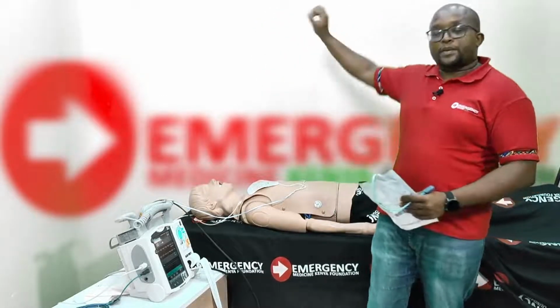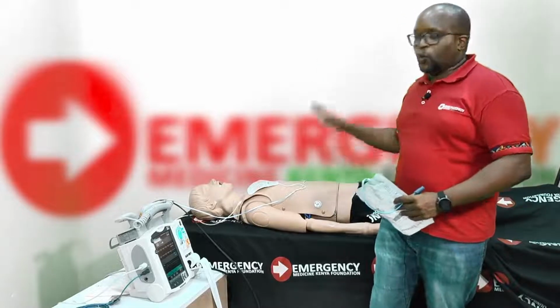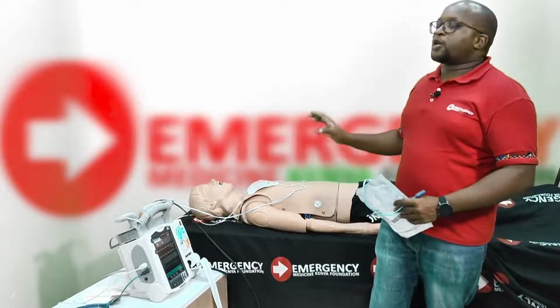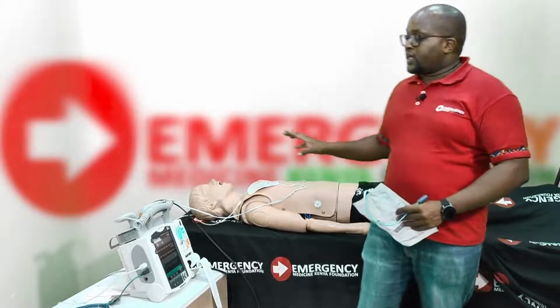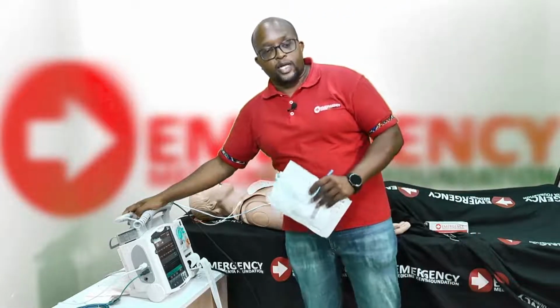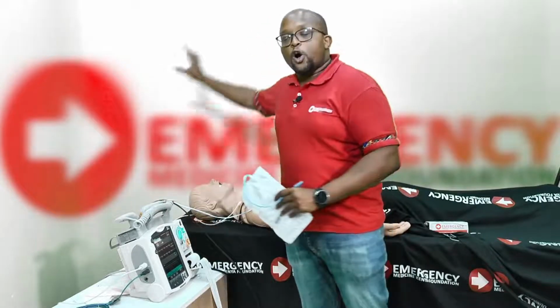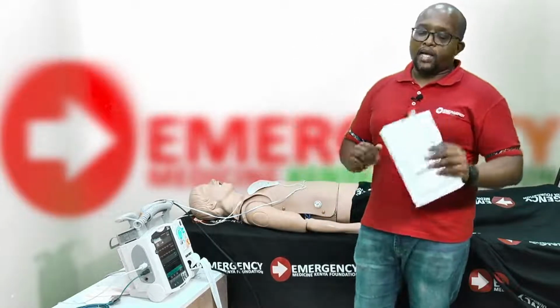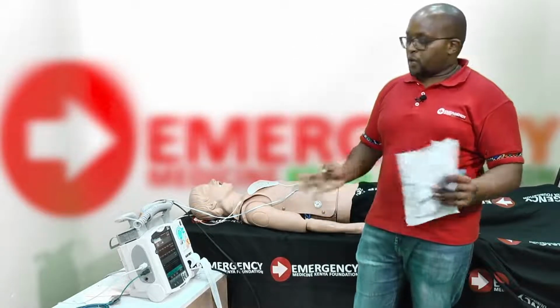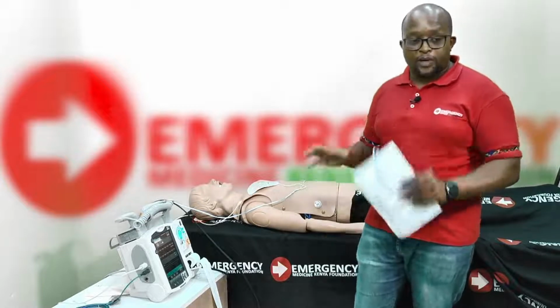And then capture the patient on your machine. When you capture the patient on your machine and go through electrical capture, mechanical capture, physiological capture, then this machine is going to go on standby, because the heart rate on your machine is higher than this one, and this one is on demand mode, in which case then you can disconnect the patient, and the EMS guys can go with their machine. So that's what we call handover pacing.